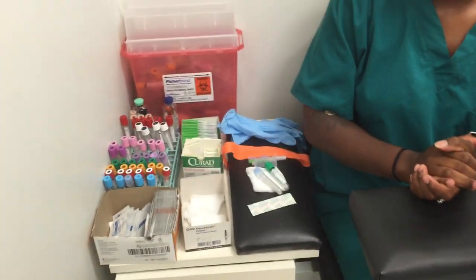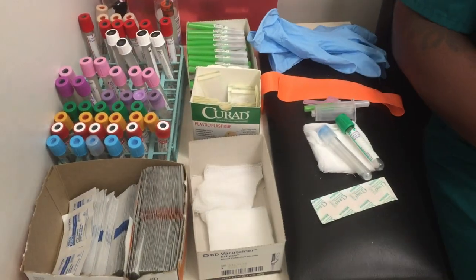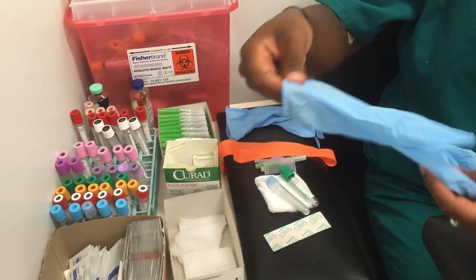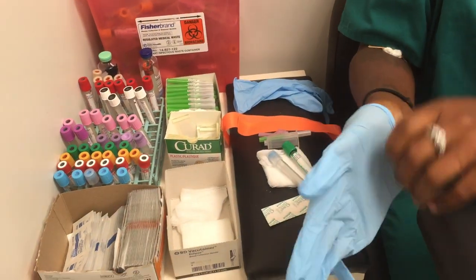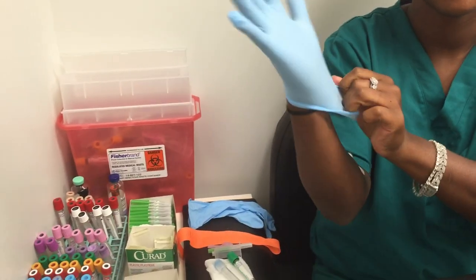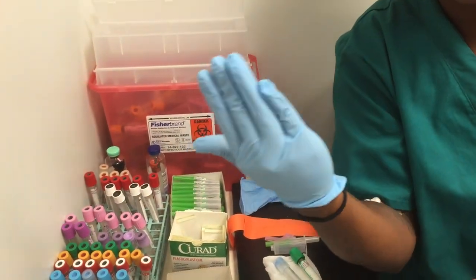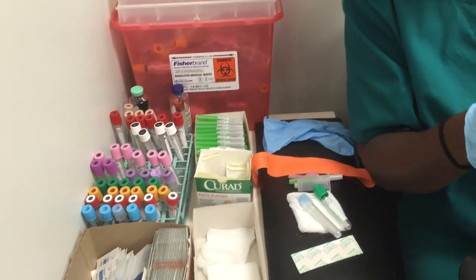Next, we will show you the actual tools to be used for the procedure. First, you will have your gloves. Make sure that they are tight so there are no gaps. These are going to help you protect yourself against any infections, blood, or anything pertaining to contamination — for yourself and the patient as well.